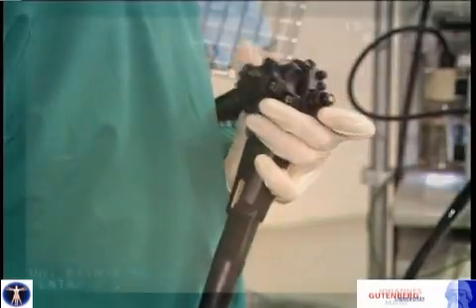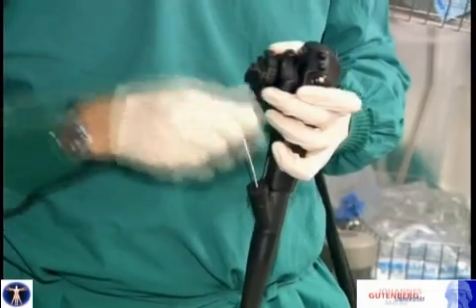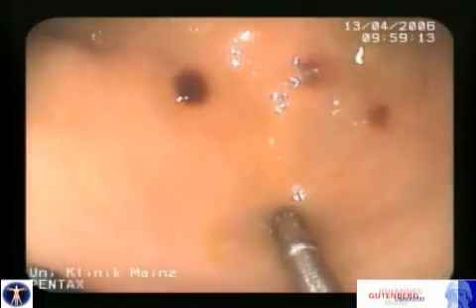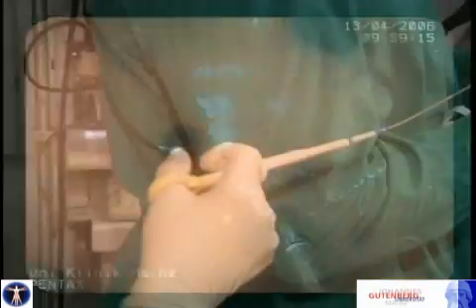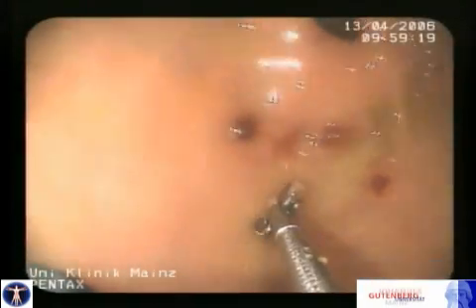The confocal microscope is localized at the left lower corner in the macroscopic view. During confocal imaging, tissue can be sucked into the working channel to minimize moving artifacts. The working channel is localized at the right lower corner. Thus, biopsies should be targeted at the left side of the suction marks to obtain corresponding specimens for final histology.